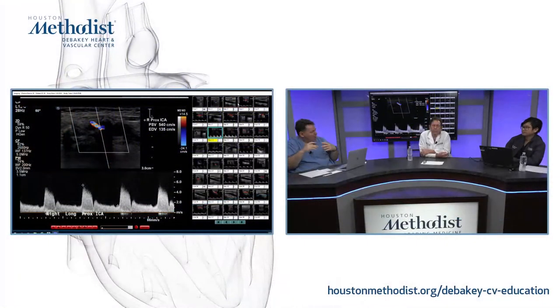From that tiny amount of flow, how did it grow to an end-diastolic velocity of 135? This is without looking at a ratio or anything else. This is giving you already a clue. This is already a 70% stenosis. But what's the clue? Why is it doing that? The clue is the 540 and 135. Why is it like that? Is this compensating, trying to get more blood flow through a narrowed artery?